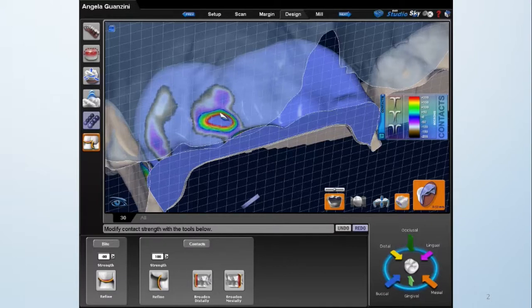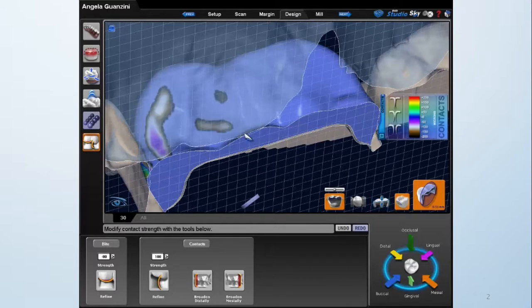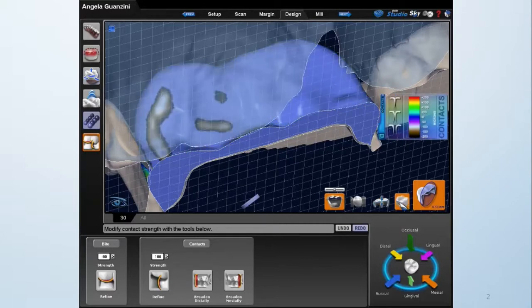So in my practice, our numbers were a little bit different. Everybody knows your colors, right? You know what colors you want on the occlusal table, so you have little to no adjustment. If you don't, that's what we're going to talk about today. So I knew in my practice that white, brown, and black still meant that my doctor had to make too many occlusal adjustments. In my practice, I could only have black on the occlusal table. If I had any white, that meant that my doctor was going to have to make some adjustments, and he didn't want to make any adjustments.